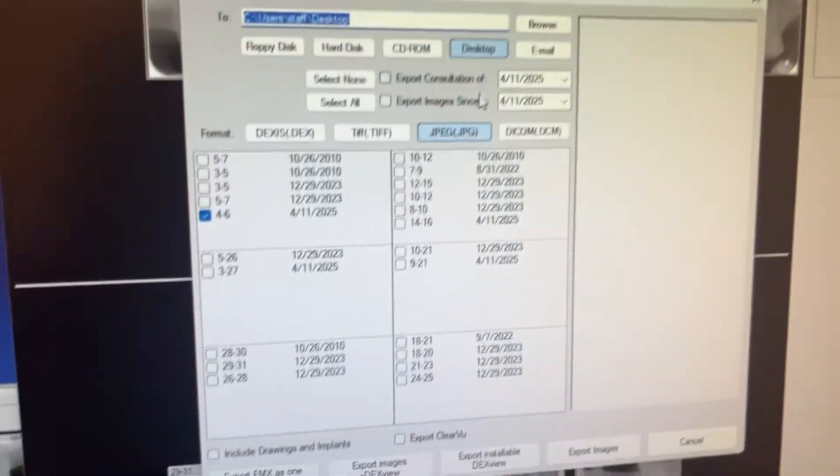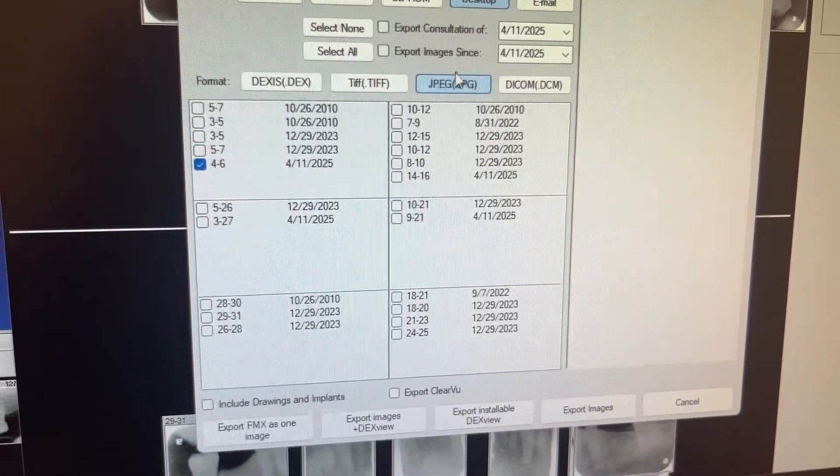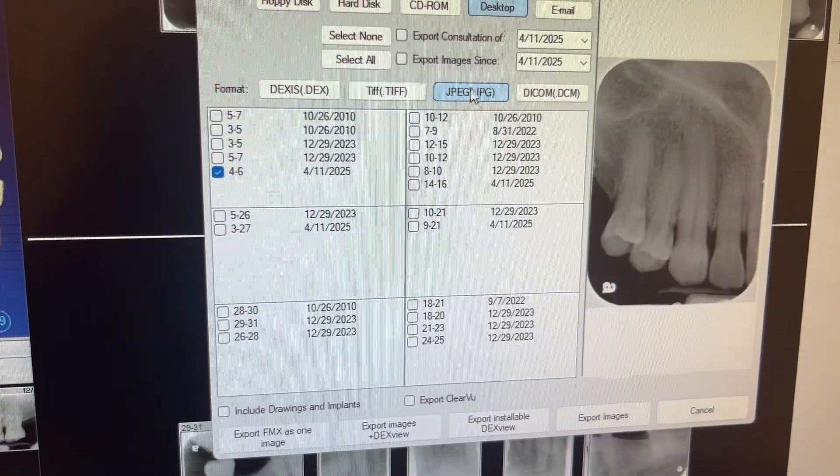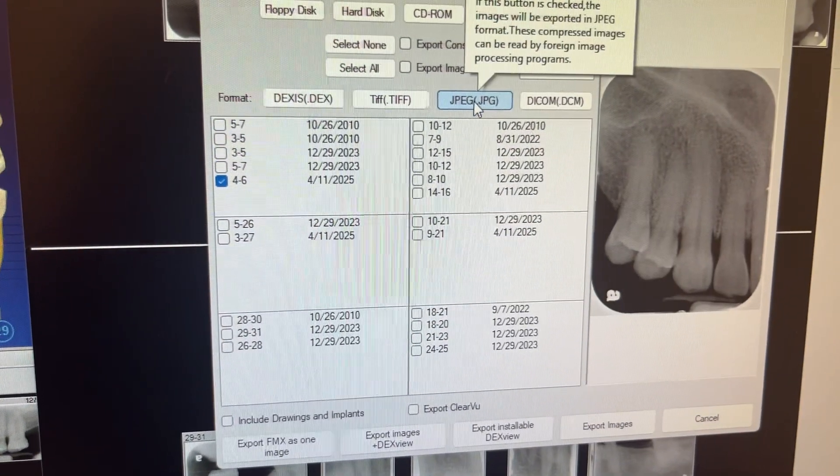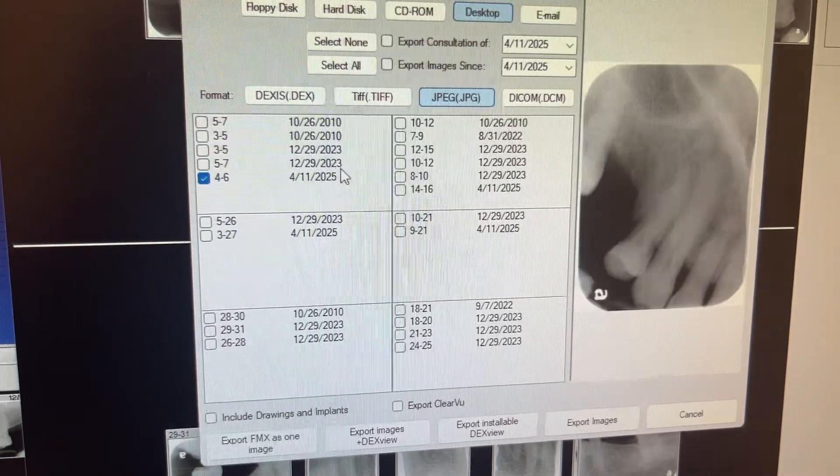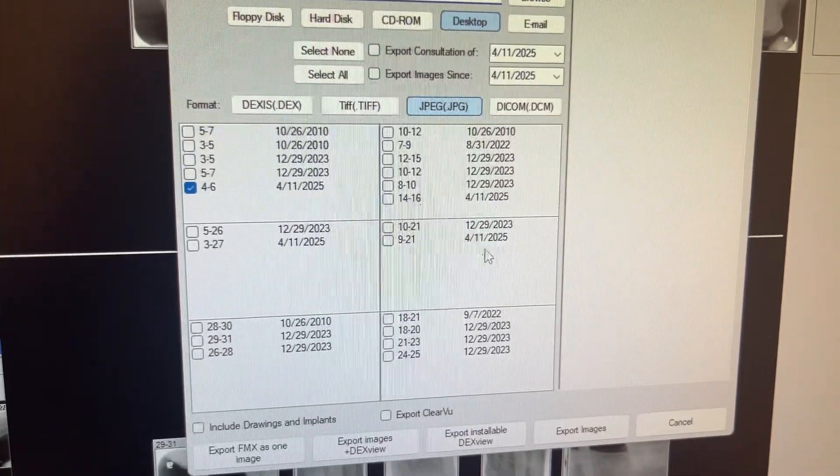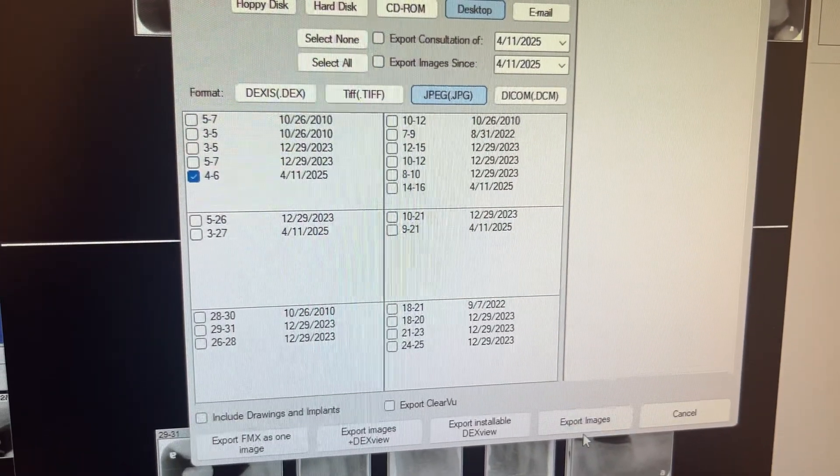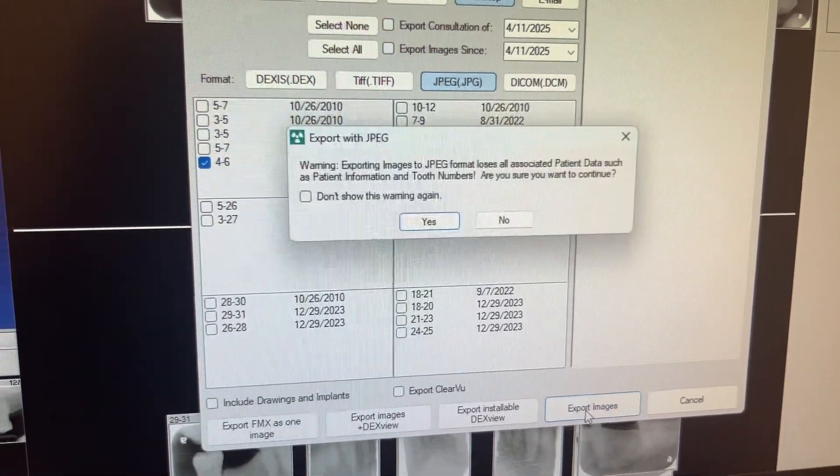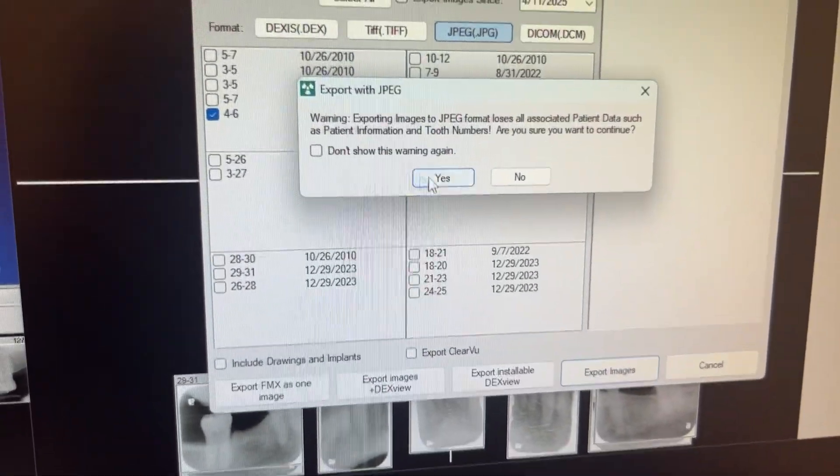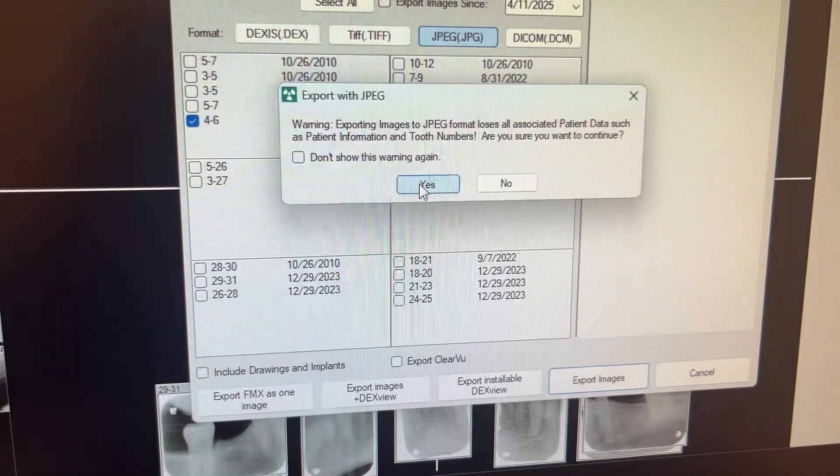So you're going to click on that. It's going to come up here, and you're going to want to pick the jpeg, the image that you want, and then the desktop, and you're going to click export images. And it's going to ask you, you're going to say yes.